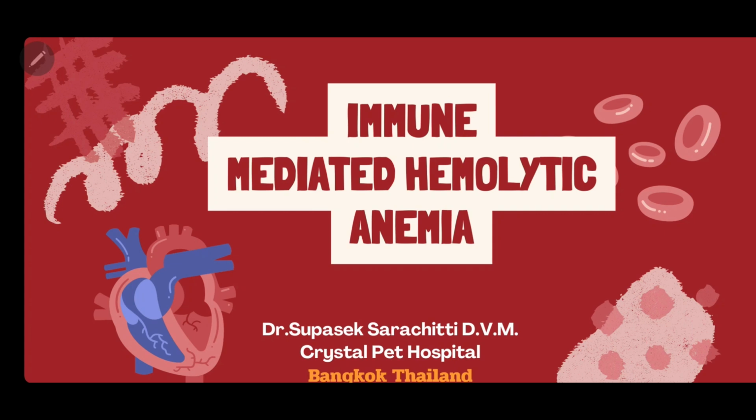In fact, diagnosing IMHA does not necessarily require flow cytometry or performing a DAT. If we have a good enough blood analyzer, or if we have graphs from scattergram or impedance, especially the older impedance, they can indicate IMHA quite well.